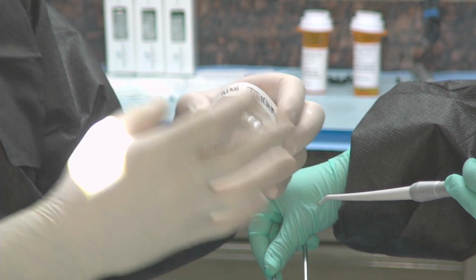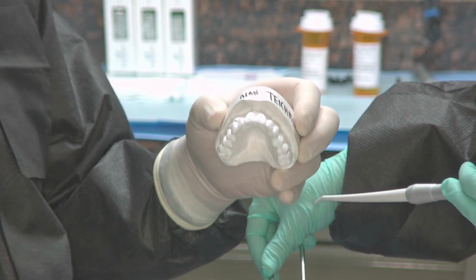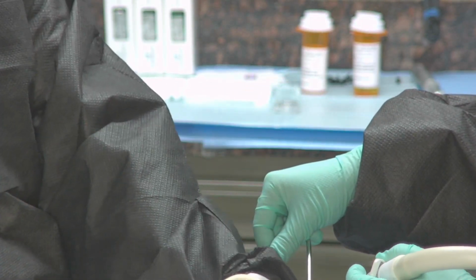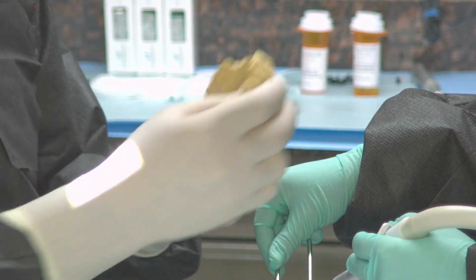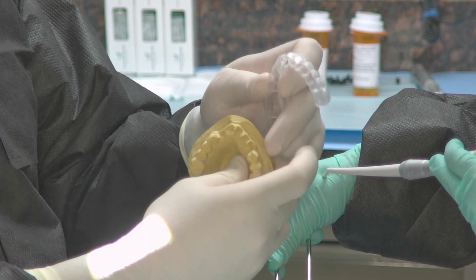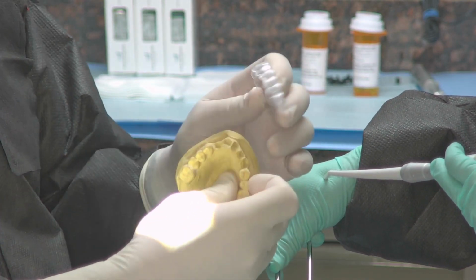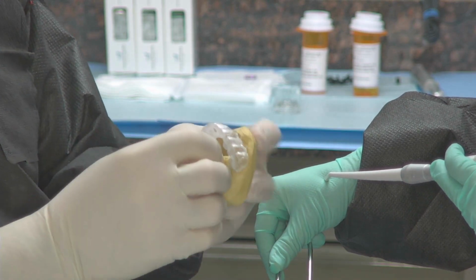This is the maxillary anterior sextant. From there, we have the model work duplicated 2 times, and we have a vacuum form made on the model that we have duplicated. And then I go ahead and I do this myself. I ovate the model so I can start getting emergence profiles.